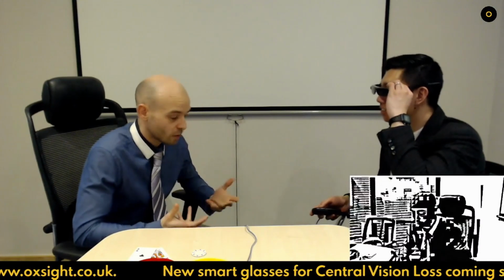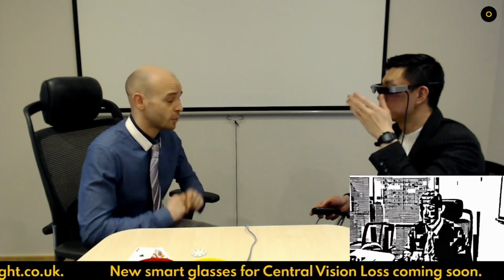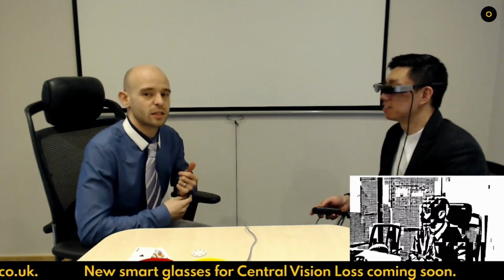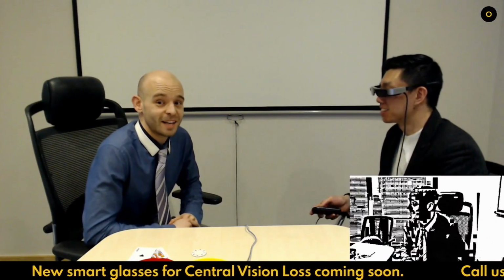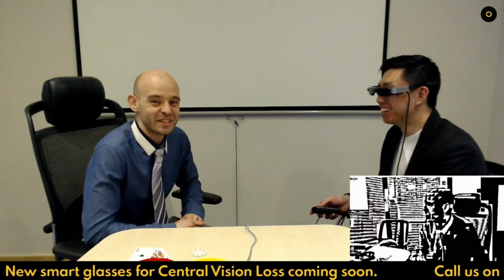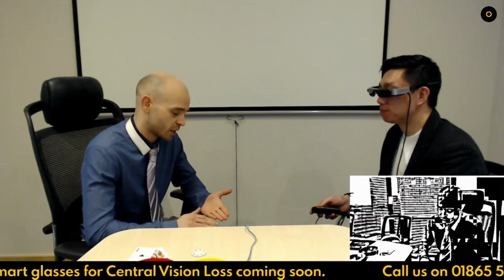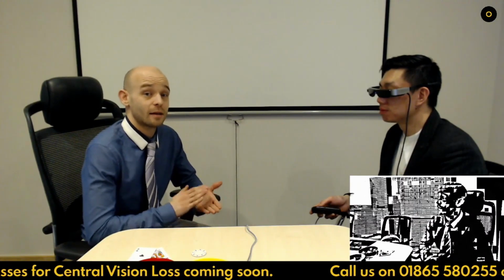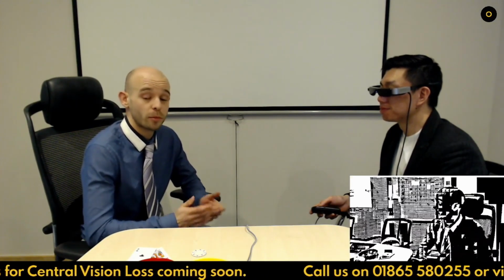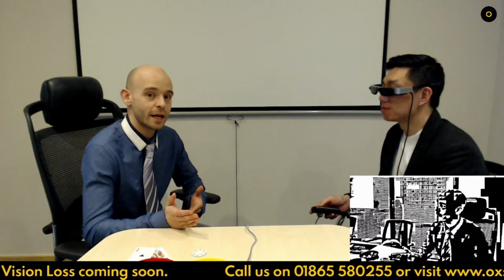If you're in a restaurant, you can see a menu, just things that people take for granted. The only thing about text is that it does make everything other than text a bit pixelated. I mean, you look like a piece of art, to be honest. Yeah, it does look pretty cool. But the good thing about it is if you've got an image in the background and writing over the front, the idea is that it pixelates the image and puts the writing clear. That's what it's there for. So you can probably use normal mode and contrast modes to get through most things, but there'll be an occasion where this could come in really handy.